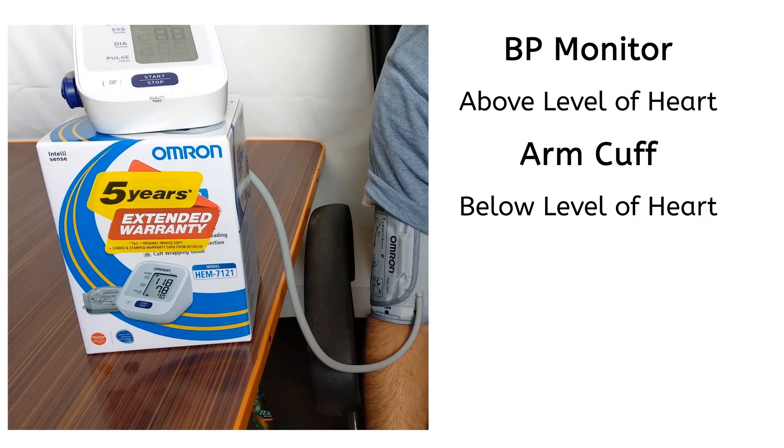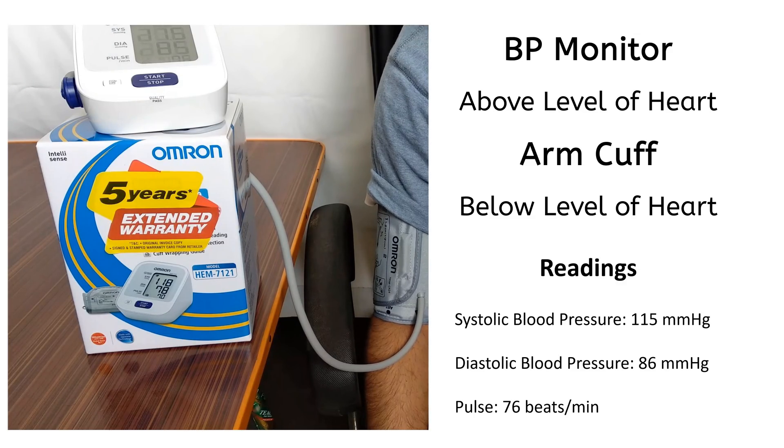This position is with BP monitor above the level of heart and the arm cuff below the level of heart. These are the readings on the monitor.